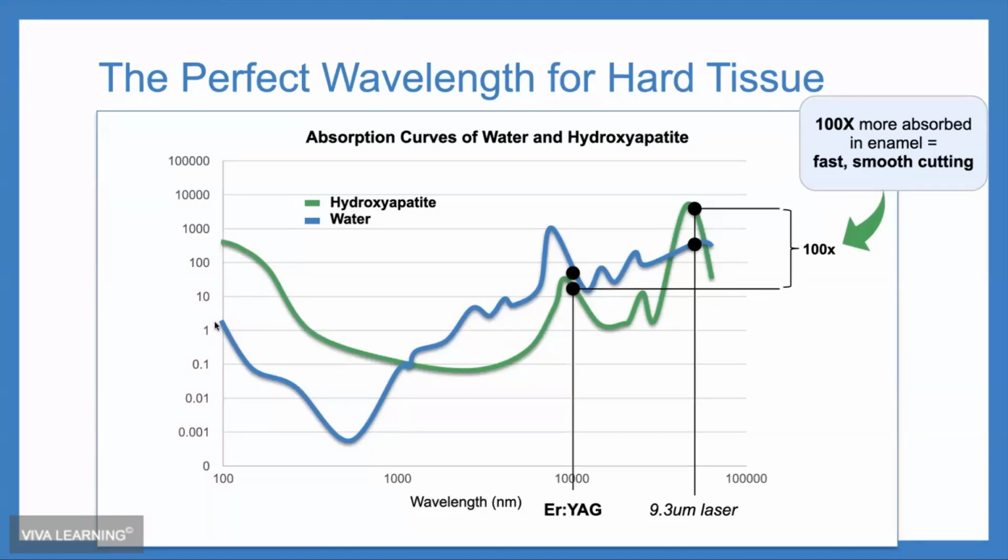But when you're absorbing something 100 times faster than another laser is, you can't help but be faster, and your settings are going to be manipulated to basically make that as efficient as possible. So we'll get into that in a minute.